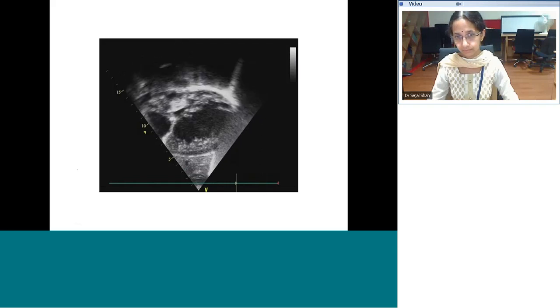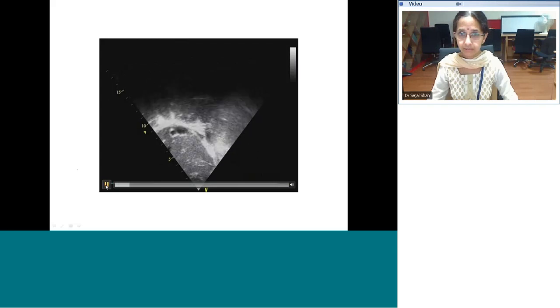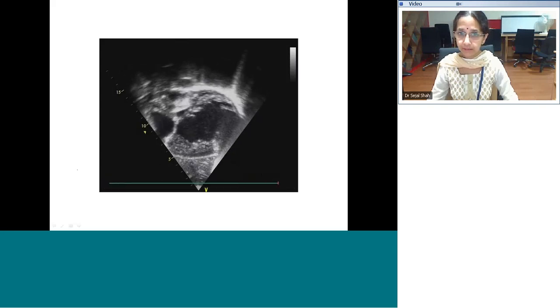In this case, we are going to have only one question and you need to tell me the diagnosis. So keep focusing. I'm going to play this a little more because it's not that common.